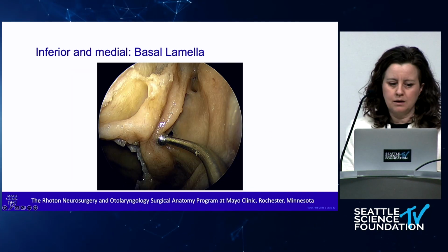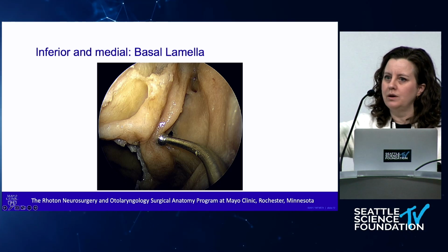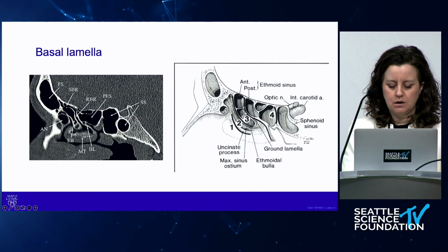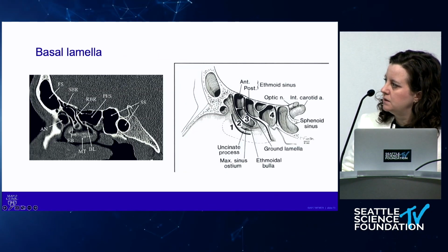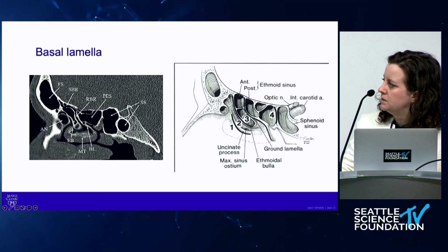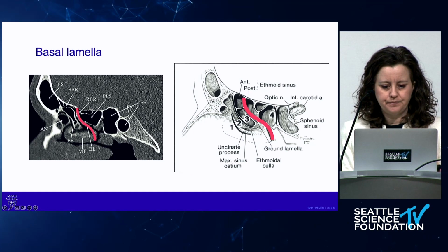So basal lamella, important landmark here. I will admit as a resident, I was like, I don't know exactly what shape that is because it seems like it goes every which direction. On a sagittal view, it's easy to see here. This is middle turbinate. This is that basal lamella here behind your bulla. It separates the anterior and posterior ethmoid sinuses.